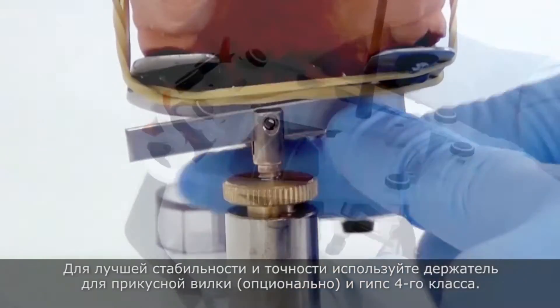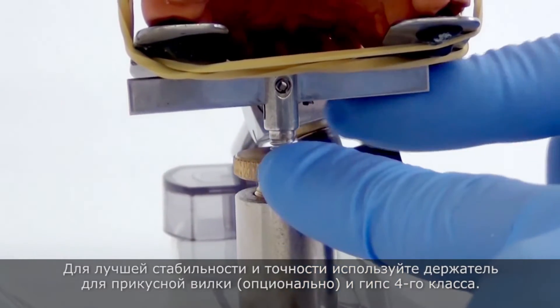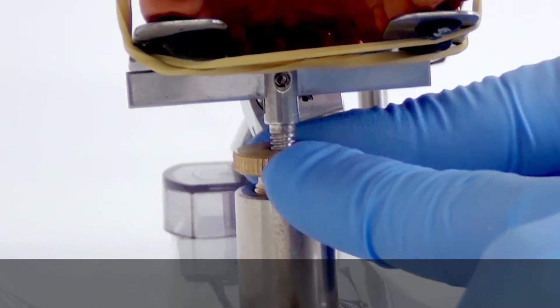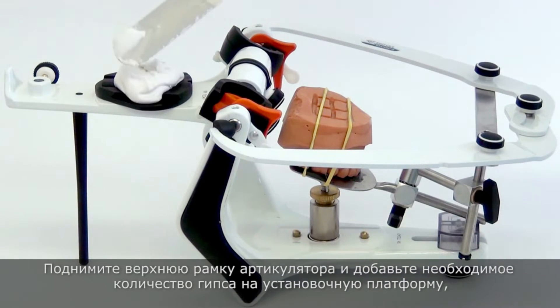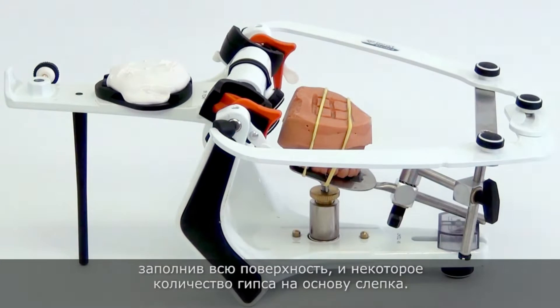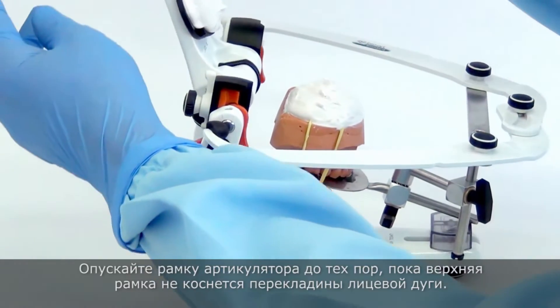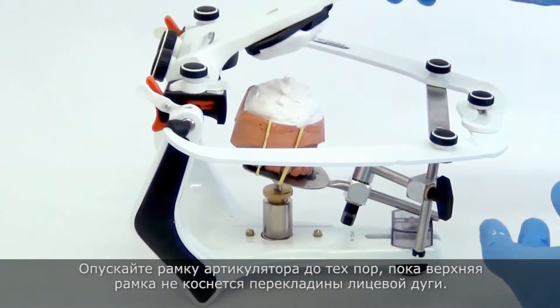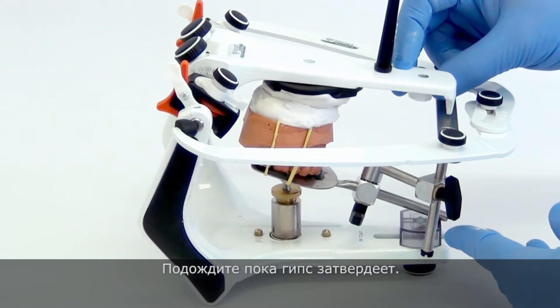For more stability and precision, use the fork support (optional) and 4-type plaster. Lift the upper frame of the articulator and add a suitable portion of plaster on the mounting plate, filling up the retentive area of your plate and another portion of plaster on the base of the cast. Close the articulator until the upper frame gets in contact with the crossbar of the facebow and wait until the plaster hardens.